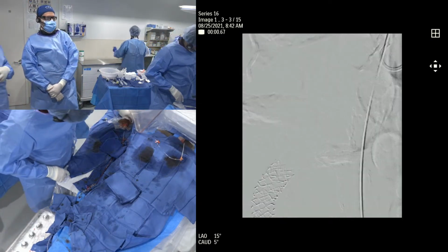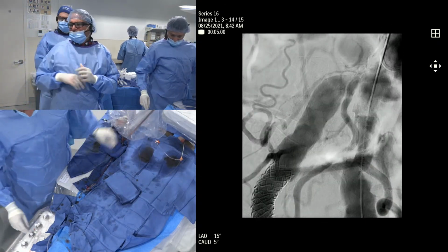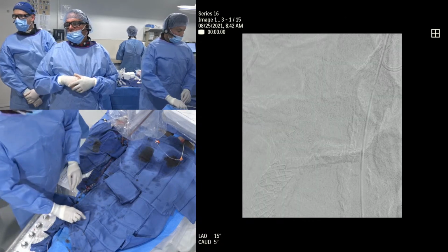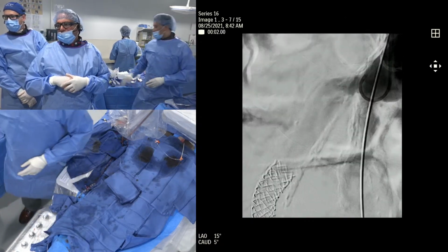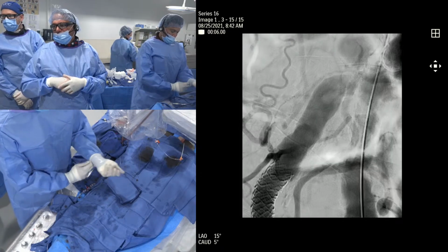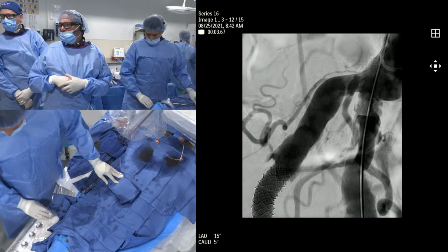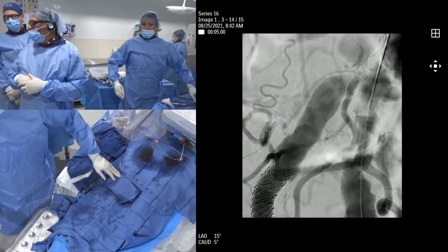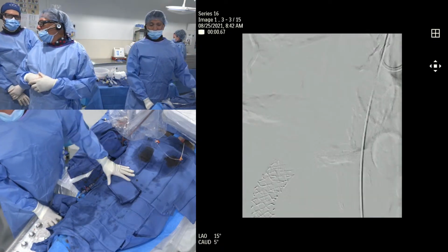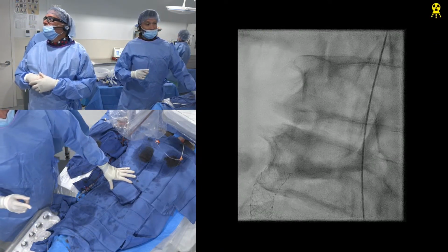When you do this, what happens is it foreshortens, right? It foreshortens. So what do you get? You guys have XLs or no? We have 8.0 XLs available, which goes for an 8 French sheath though. But no 7.0 XLs. What's that distal iliac measure, guys? 10.5, 11. It's 11. But it's in the aneurysmal pouch, though. Yeah, but the point is, we should.